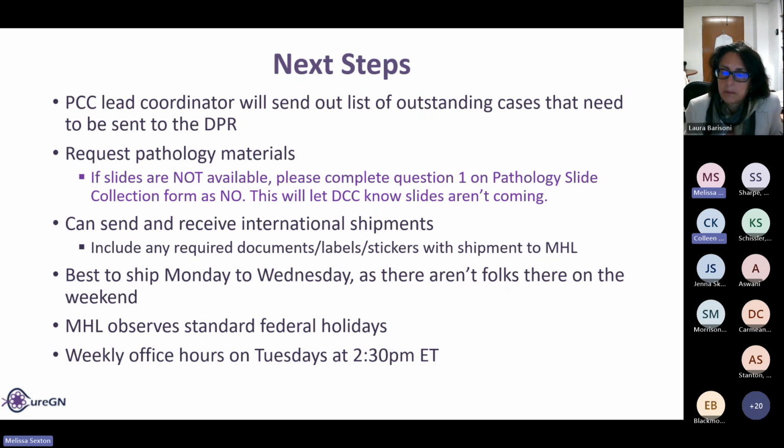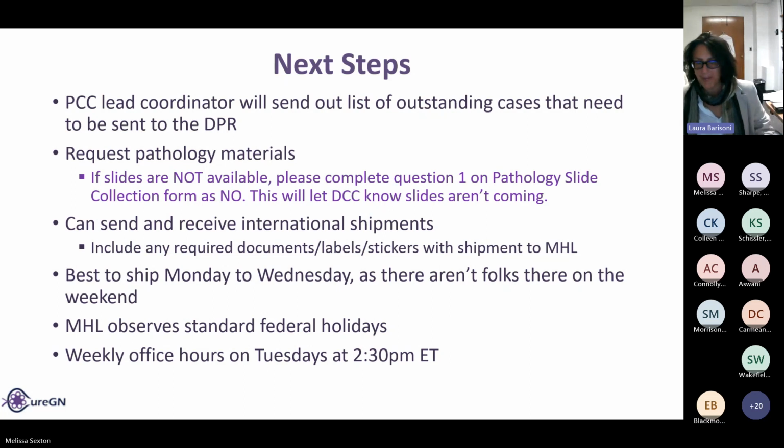Thanks. Okay. Oh, that's what you were asking about, the scan slide. Okay, yeah. And make sure that you fill one for each patient, because what happened, I think that was said already, is that AMHL receives a certain number of cases, but only some are recorded, or vice versa. That creates a lot of delays because they have to stop, because they don't know what to do. So the paperwork has to match the slides.